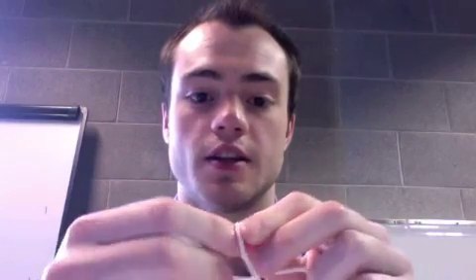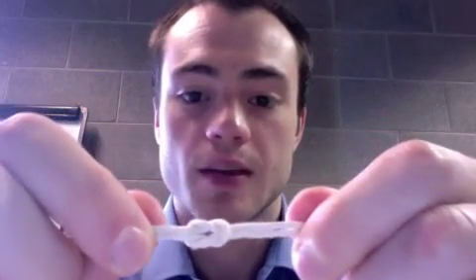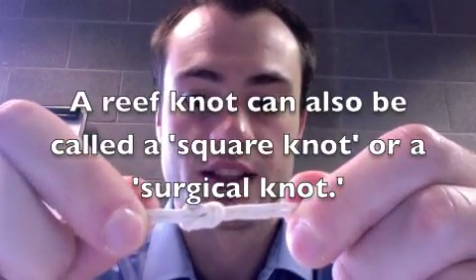Left over right, loop it through, right over left, loop it through. This is a reef knot. You can see that when greater tension is applied across it, it gets tighter.